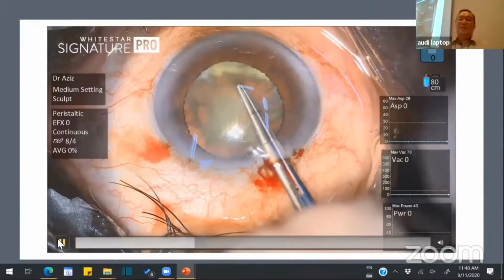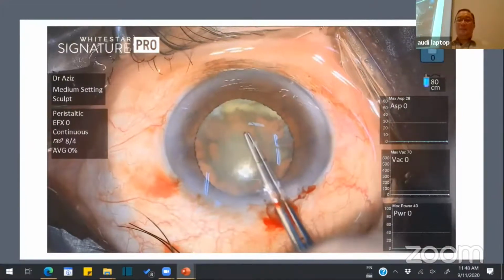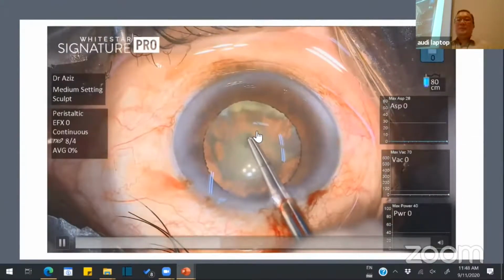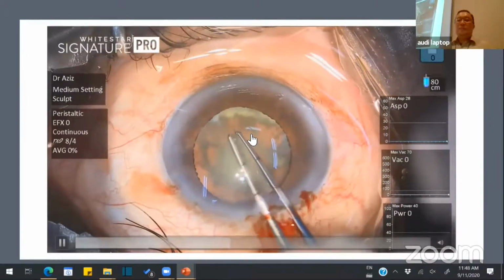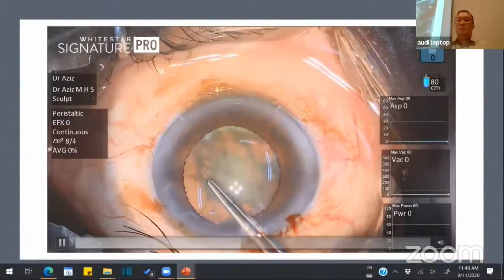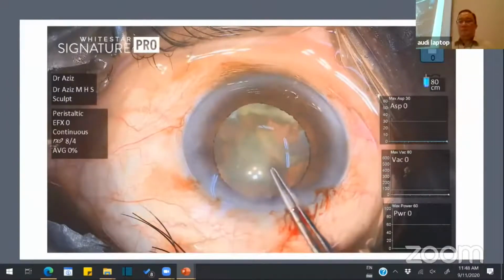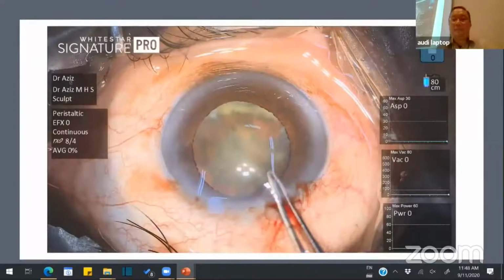So it's vertical, actually you are tearing it down, get the flap. So sometimes you are not that lucky, sometimes the view is not good, you know, because of the CCC. But you can still see it. So the direction of pull is all towards the center.